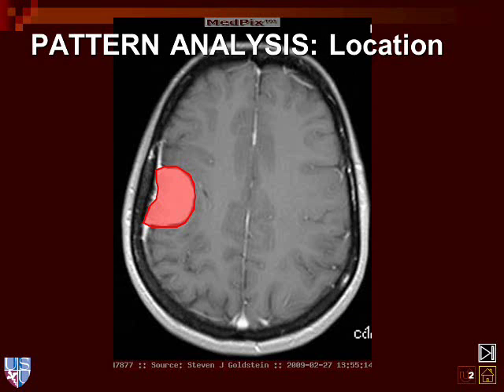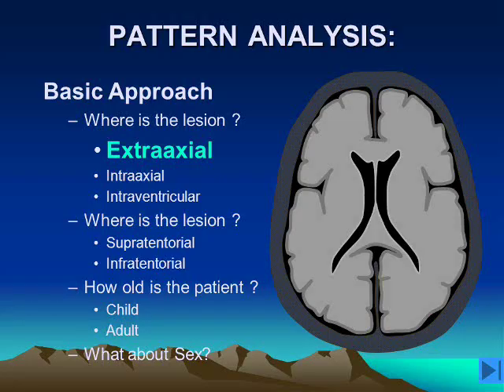After we give contrast material, we can see on this T1-weighted MR image that the lesion is enhancing, and there is also enhancement of the dura underneath the hemispheric-shaped lesion. So we have a classic extra-axial mass lesion.